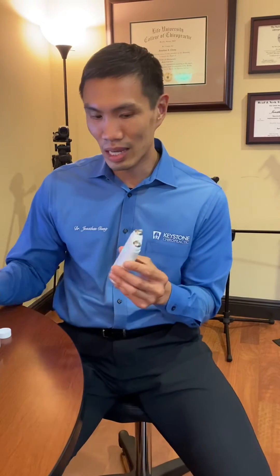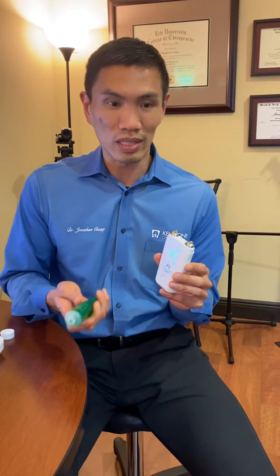It's Dr. Jonathan Chong again and we're talking about vagus nerve stimulation and how we could use the GammaCore to help treat patients with migraines. Here's that GammaCore device again and what we do in order to show you how this device works.